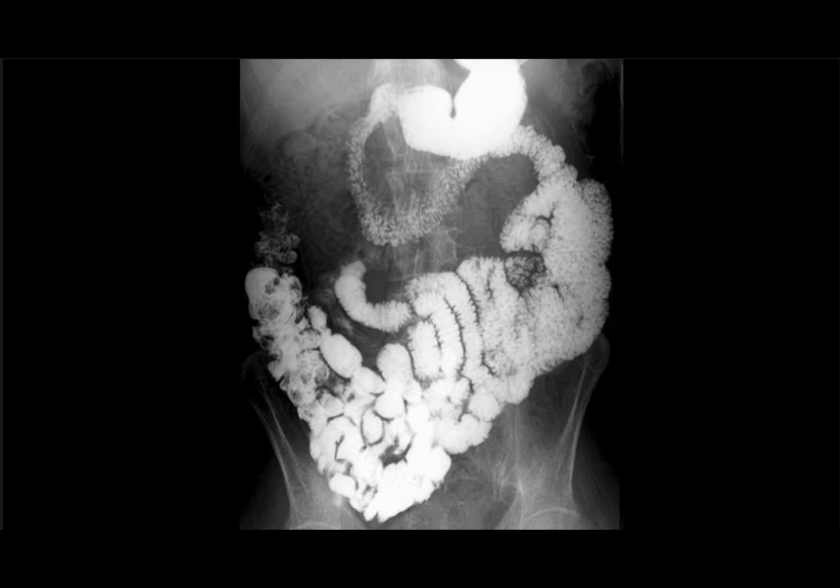So just like in barium meal and barium swallow, for a barium follow-through, the patient drinks the contrast. The contrast moves from the esophagus to the stomach and then to the small intestine, the duodenum, the jejunum, and then the ileum. So the barium follow-through is very different from the barium enema.